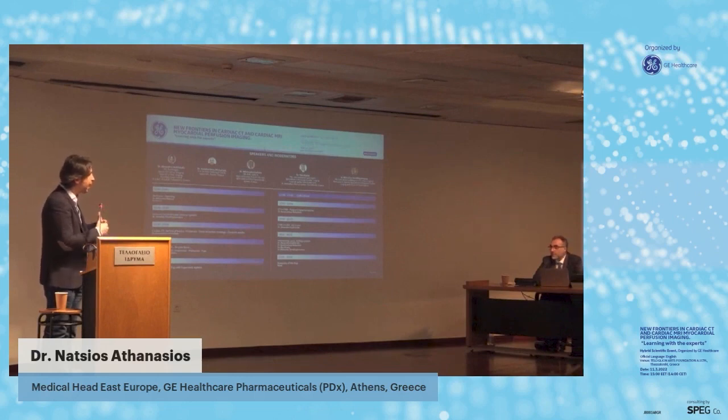I saw that we also have additional algorithms with movement correction. Of course, if the patient is not collaborating well or is in an unstable situation, it is difficult to proceed with stress techniques. The breathing can affect the final result and diagnosis, but we have algorithms and techniques to reduce this problem. Also, if we want to see the global or segmental function, we can additionally use real-time cine sequences, which are free breathing, and we have a good overview of the heart function.